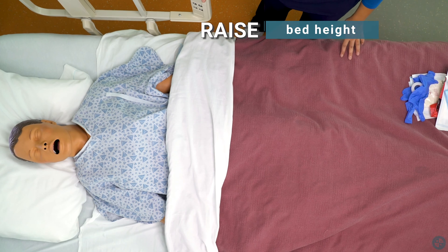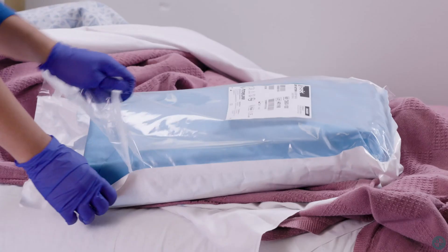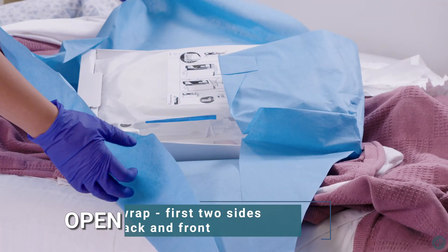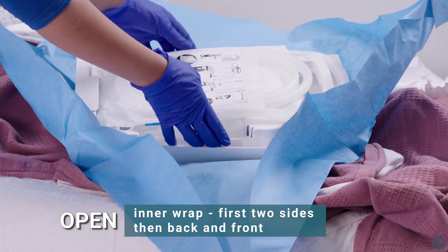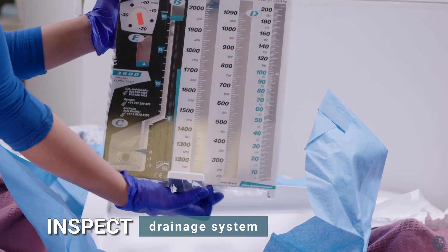Raise bed height. Don clean gloves. Remove outer wrap of drainage system. Open inner wrap — first the two sides, then the back and front. Inspect new drainage system. Swing floor stand open for setup.